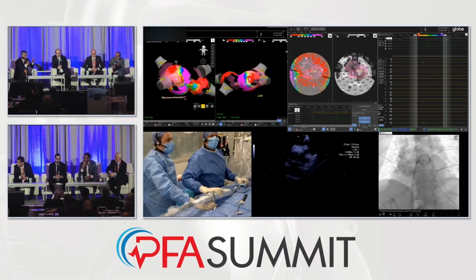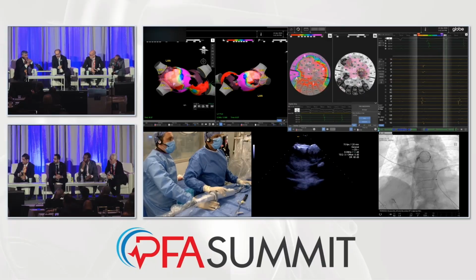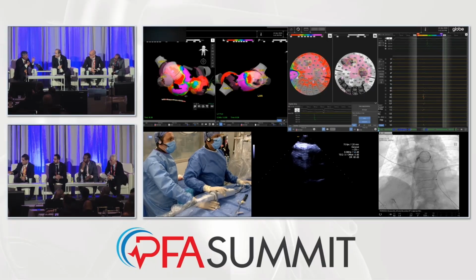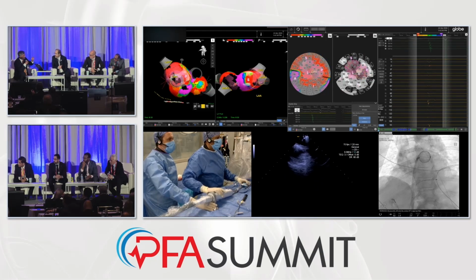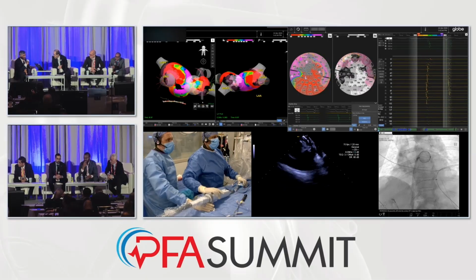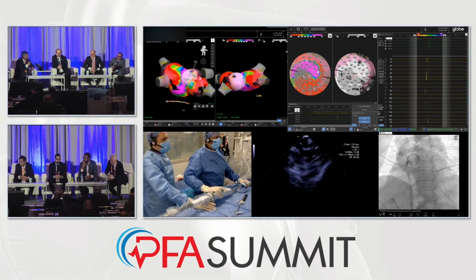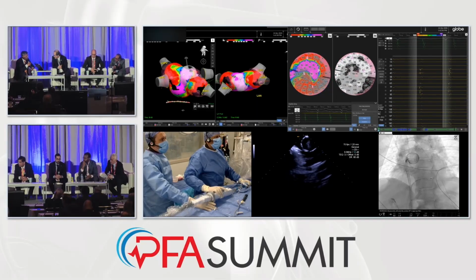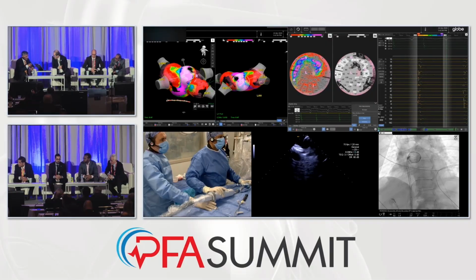It's true with this technology. The other one I have experience with is the balloon with the endoscope, the CardioFocus balloon, where if you can see that you have contact with tissue, you're going to get a good lesion. So I think some of it probably has to do with the waveform, and some of it probably has to do with the contact. But I bet that when you have good contact, you get good durability.